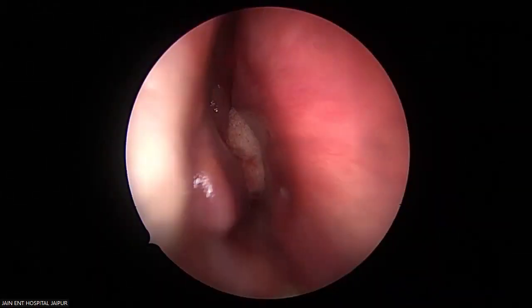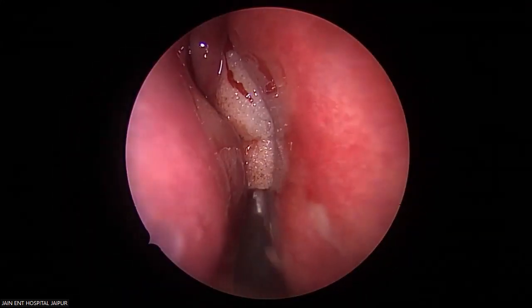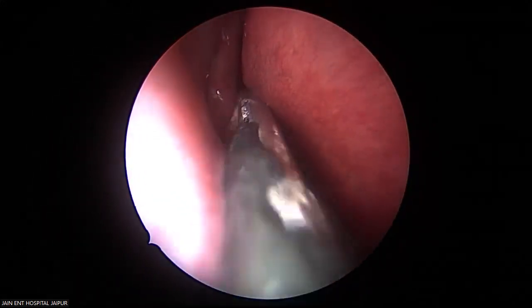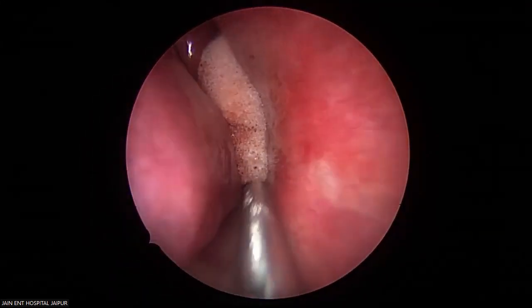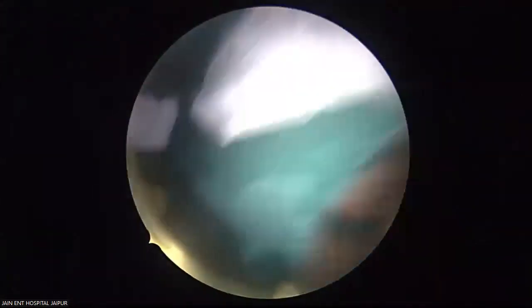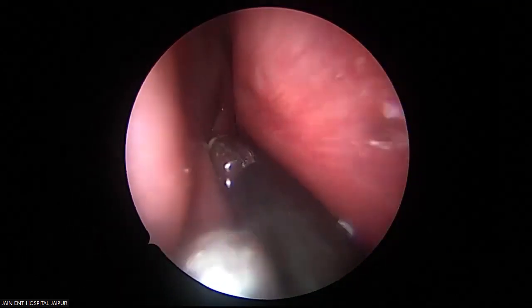Initial surface decongestion of the nasal cavity. See this, to open up the nasal space. Much better. The tumor I have initially covered with the Merocel so we don't come onto the surface with our instrument and damage it. Our goal is to do a modified Denker's first, so that we can get, as I showed you on MRI, the kind of exposure we need.